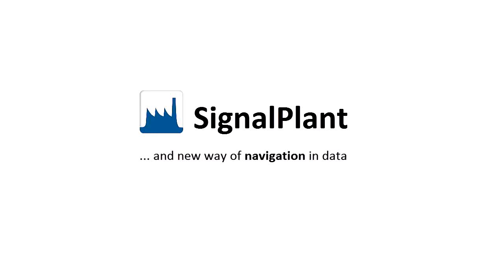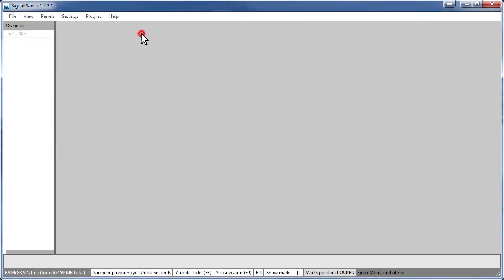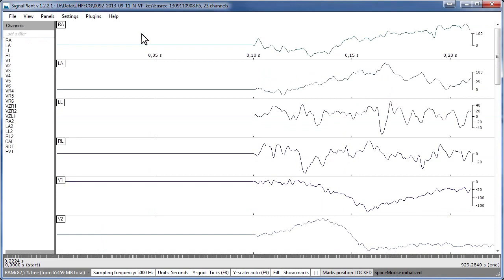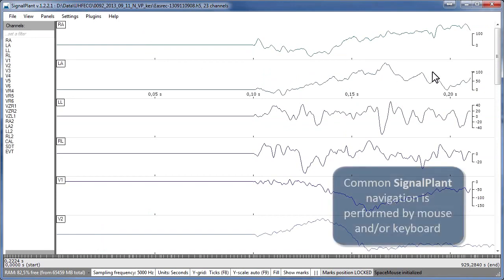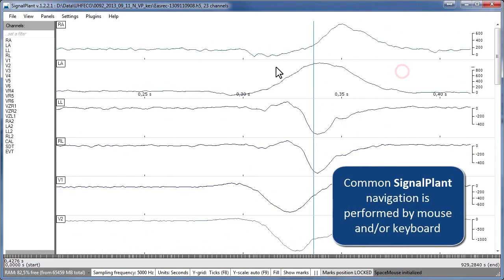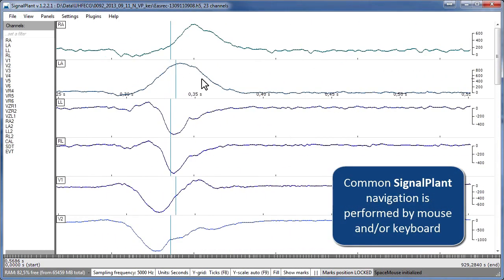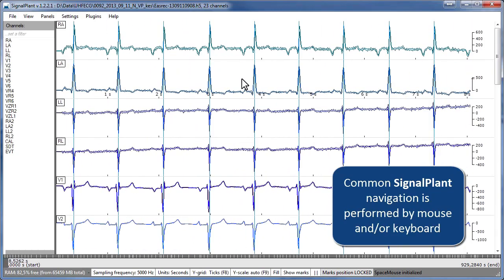Hello again. Today I'd like to show you a new way of navigation in SignalPlant. We already have several ways of navigation such as mouse gestures, mouse wheel, keyboard, or manipulation with navigation bar.